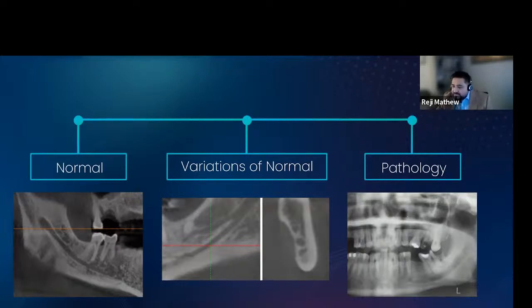When you take an MRI, you have different sequences. MRI uses radio frequencies, or RF pulses, so there are different sequences which you would be able to look at. Some of those sequences are T1 imaging, where the fat appears bright, and T2 imaging, where the fat and the water are bright. And there are other sequences called STIR sequences and FLAIR sequences, in which in a STIR sequence only the water is bright, whereas in the FLAIR sequences, the water is suppressed.